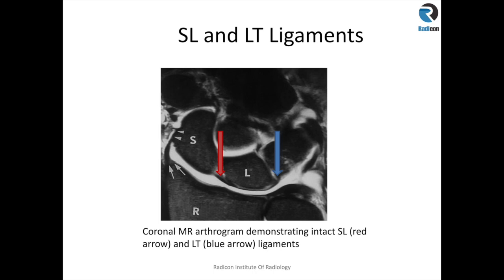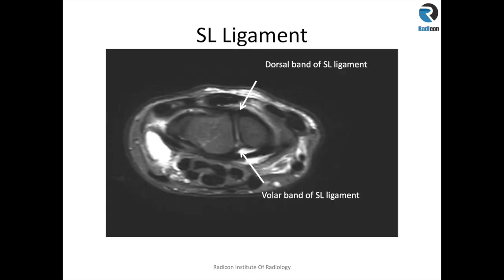The coronal MR arthrogram demonstrates the intact proximal part of the scapholunate ligament and the lunotriquetral ligament. There can be a small central perforation in the proximal part of the scapholunate ligament, which is a normal variant. Therefore, you have to assess the whole of the findings in the axial plane as well before calling it a tear.